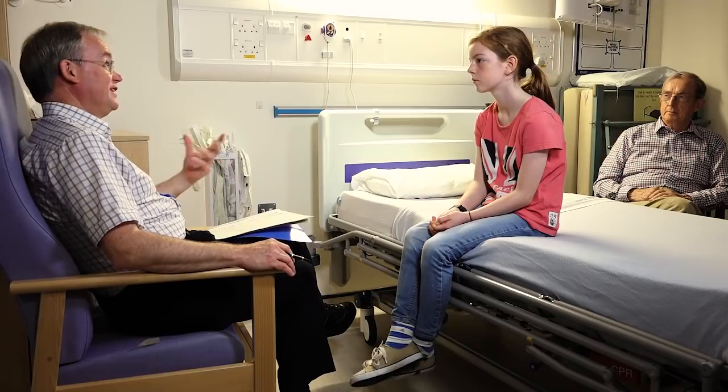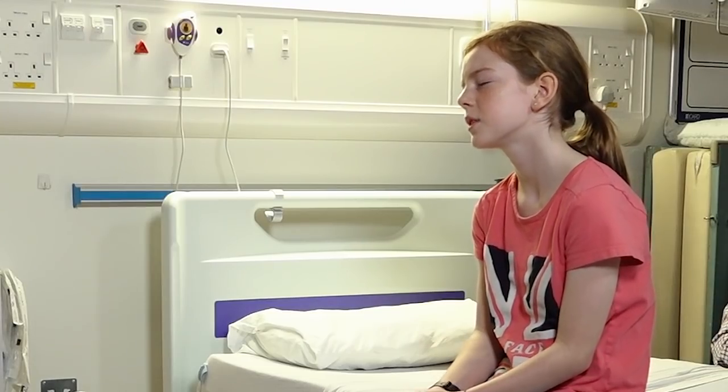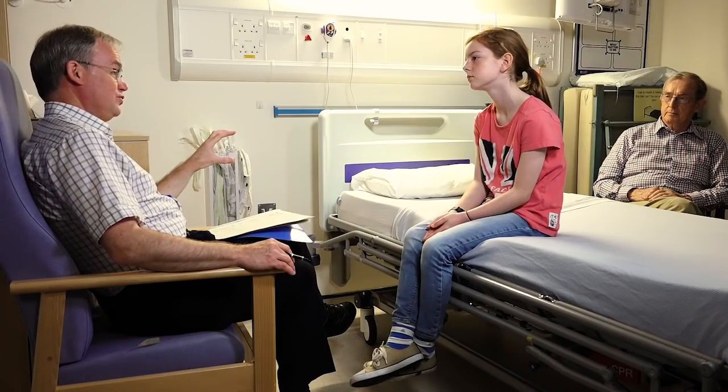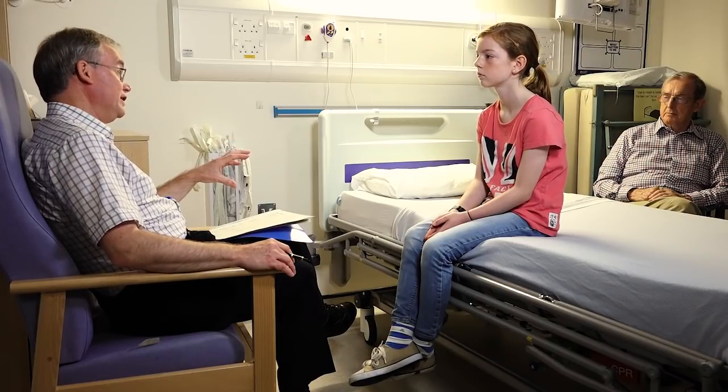We're here to show people what it's like for children who come for a sleep study. Why would anyone need a sleep study? Quite a number of children might have problems with the way they're sleeping at night — they might not be sleeping very well or feeling very great after a night's sleep. With a sleep study, we can find out what's happening with their breathing and sleep at night and try to work out what's going wrong so we can work out how to help them.